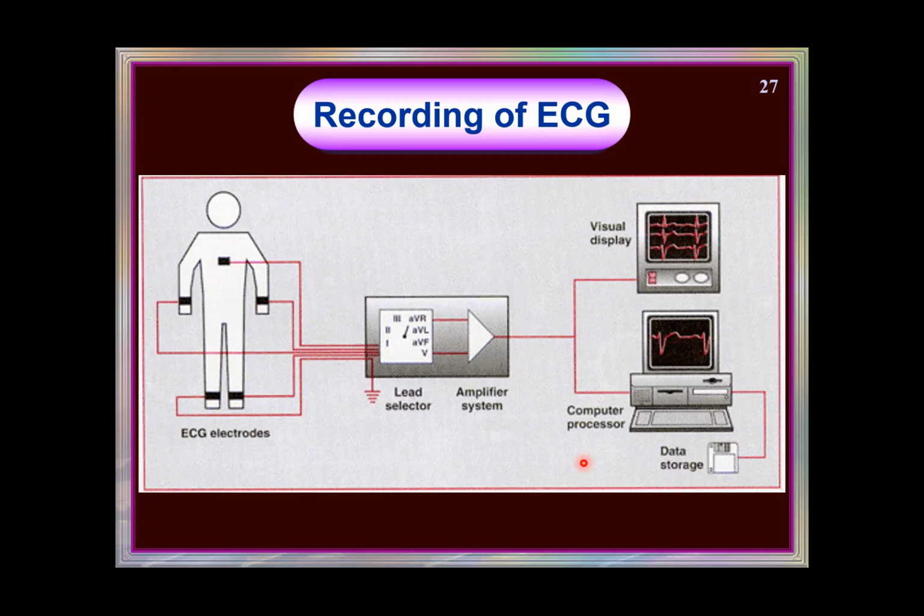So actually when the ECG was first invented, what did they do? A person brought a horse and took 4 glass buckets, not metal buckets. In the glass buckets, he poured saline. In the 4 glass jars with saline, he made the horse stand with its 4 legs in the 4 glass buckets.